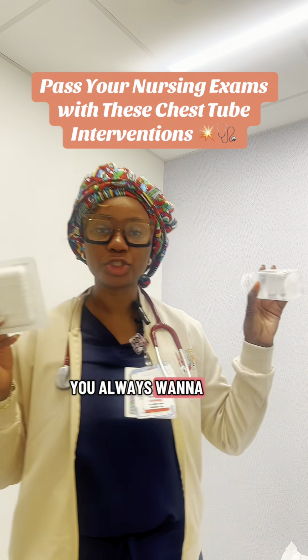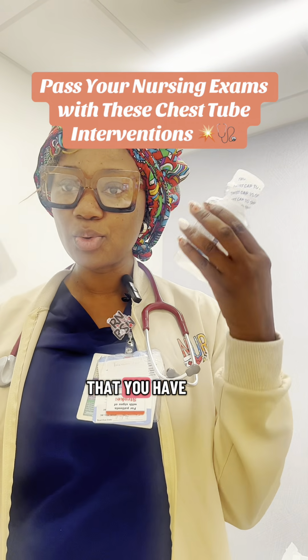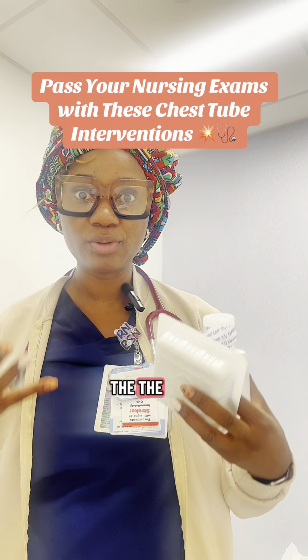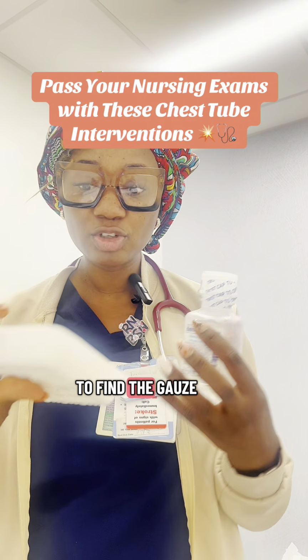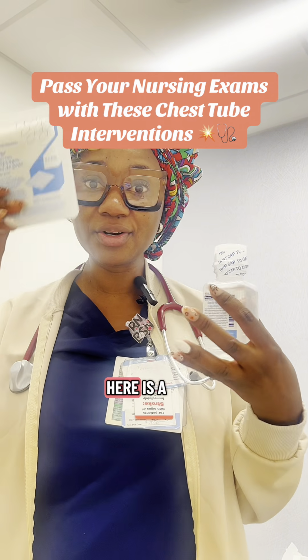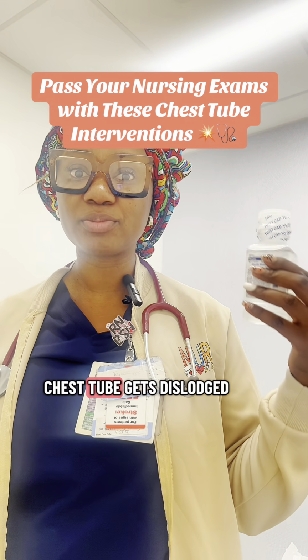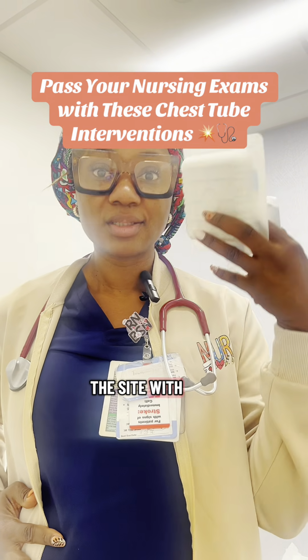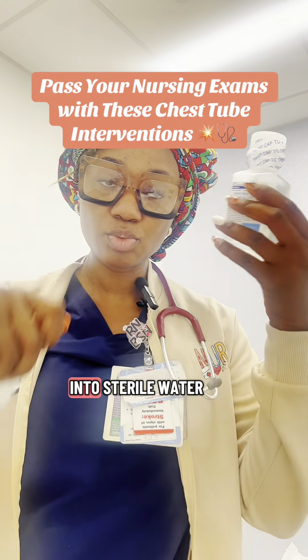When you have a patient that has a chest tube, you always want to make sure that you have gauze and you have sterile water. Okay, petroleum gauze is the preferred. I wasn't able to find the gauze, but hey, here is the gauze, and you have sterile water. So when the chest tube gets dislodged, you want to cover the site with some sort of gauze, and then you want to put the other part into sterile water.